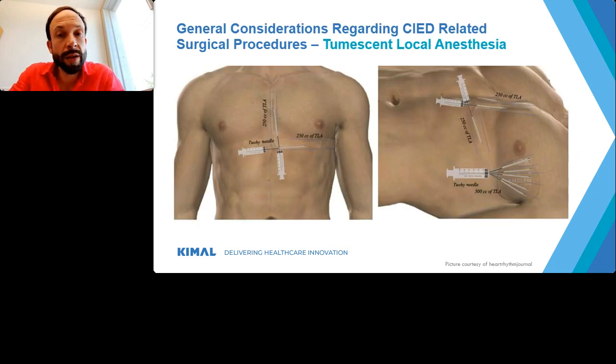This is referring to what I said whenever conducting tumescent local anesthesia in a CIED implant. You use a special kind of needle which is perforated, and there you can see the amount of liquid you will be infiltrating in these areas, so it's a lot.